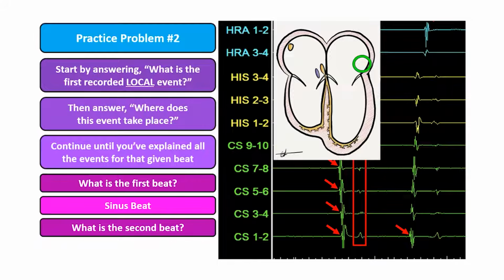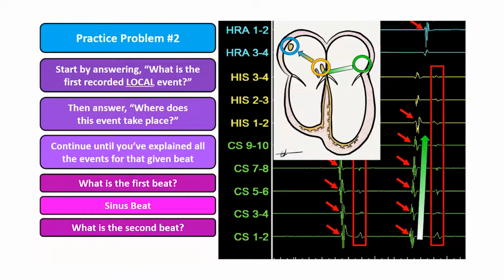Looking at the order of near-field electrogram activations, we see now that the wavefront moves from lateral to septal in this direction before it reaches the area of the AV node. And here we see that our high right atrial catheter in this location is actually activated last for all of the near-field atrial electrograms we can see. We still see far-field ventricular electrograms here, showing us that our wavefront does make it down the AV node in the HIS Purkinje system, and the ventricle is activated.